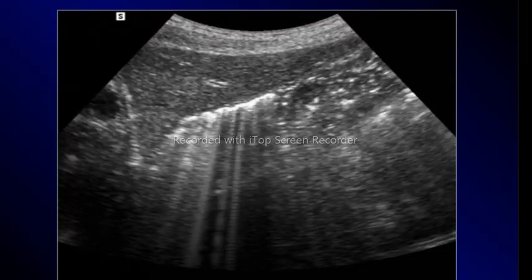So this is an example of gas pockets. As you can see there, multiple of them giving us shadowing, so you never see what is behind there. Same thing here. Yes, these pockets of air are not that big to cause these shadows, but you can see that there is haziness here, and you can never assess what is behind there. So even if there was a mass here, a gastric mass or duodenal mass, you will almost always miss it.